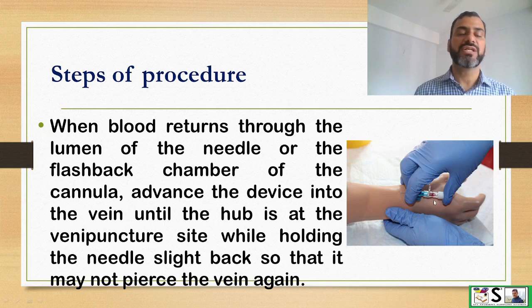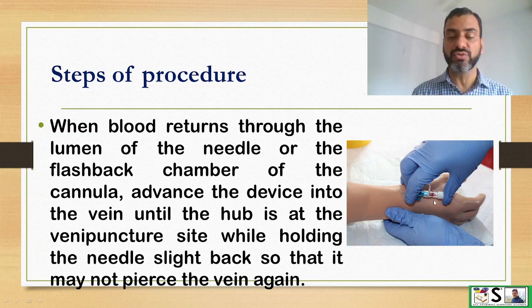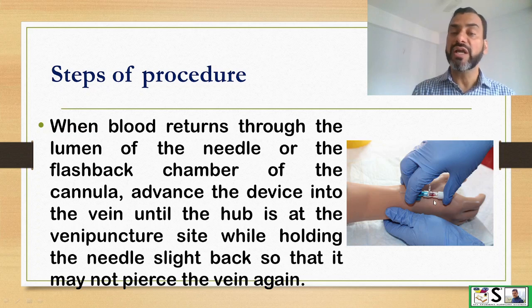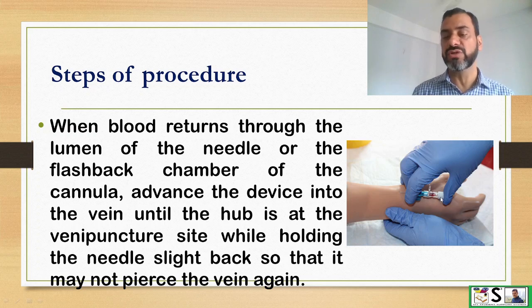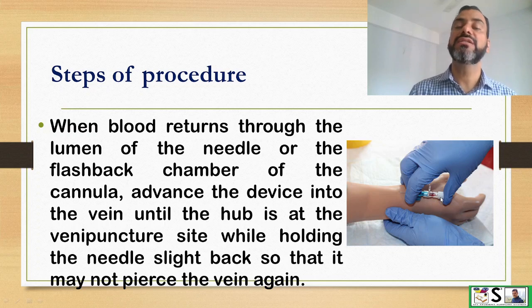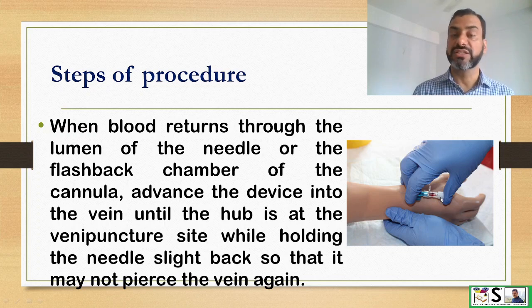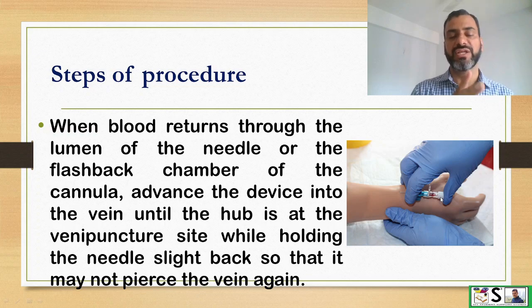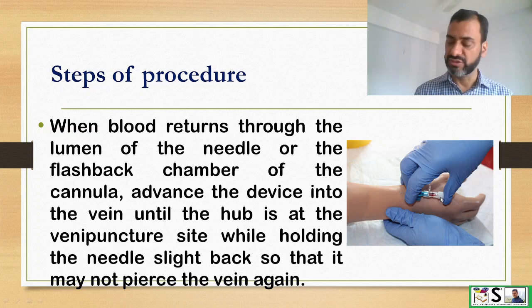Advance the device into the vein until the hub reaches the venipuncture site while holding the needle back. The needle should remain held back as the cannula is advanced, so that the needle does not re-puncture the vein and go outside.